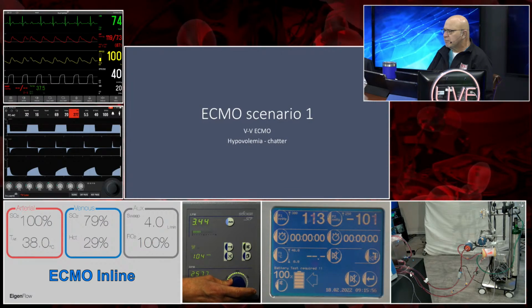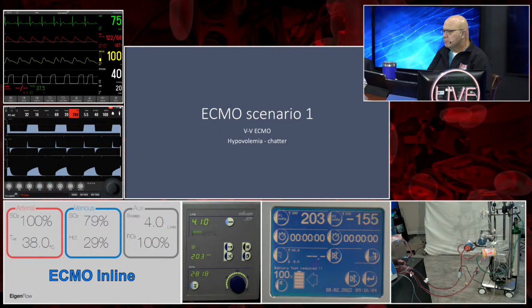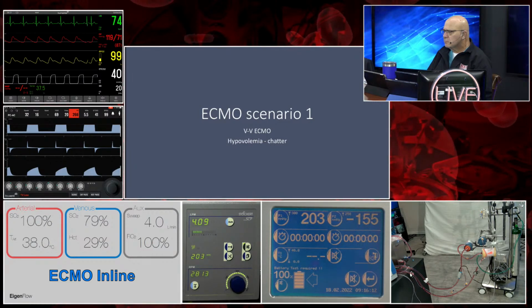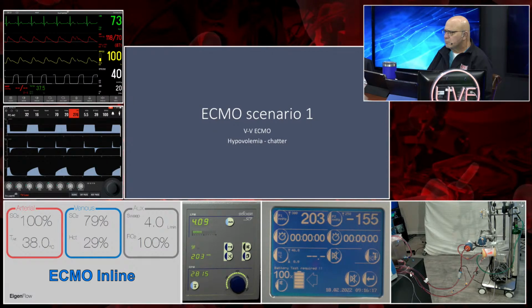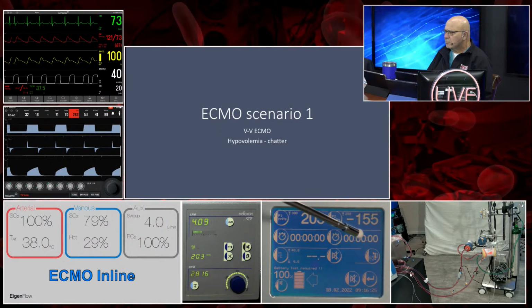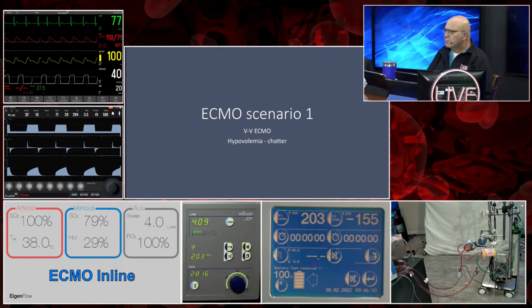You see how she turns the flow up by simply turning the rheostat control, increasing the RPMs. That's good, 4 liters. I'll move my hand away, and you can see that our pressure increased. Our pressure is the center number, our RPMs are at the bottom, and liters per minute at the very top. The next screen on the SCPC is our pressure screen. We've got our negative pressure here, which is our pre-pump pressure, and it's expected to be negative. Then we have our post-oxygenator pressure, which is positive, and we expect that to be positive.